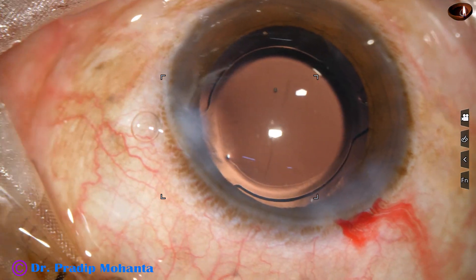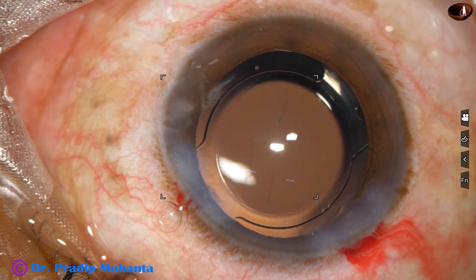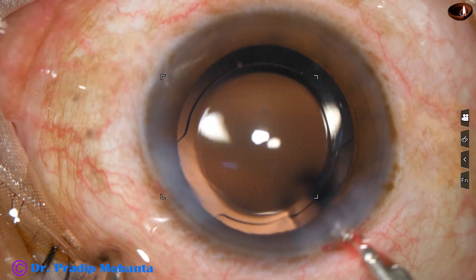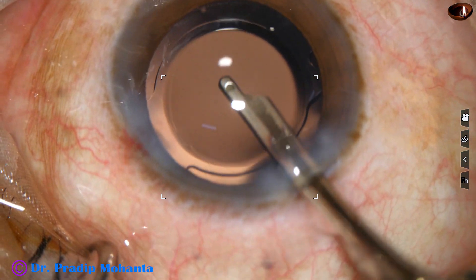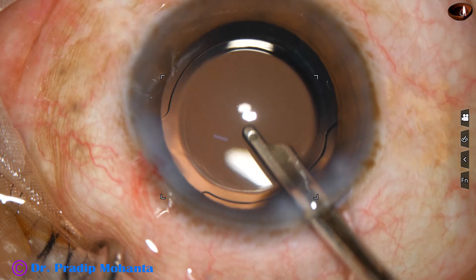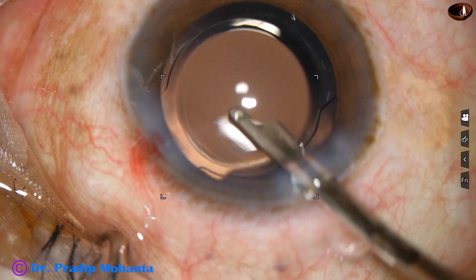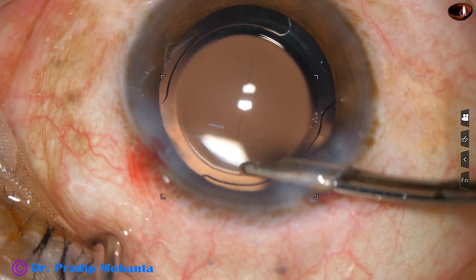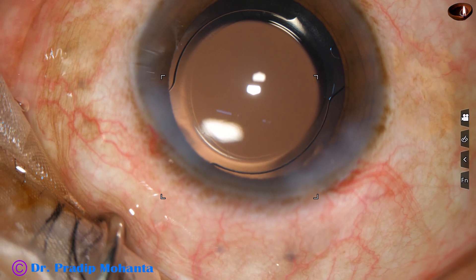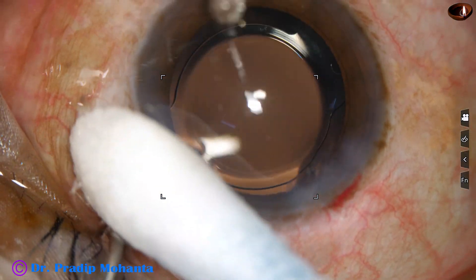I close the side port — in this case only one side port has been made. I close the side port by hydrating the corneal stroma. Now this is the final lavage of the anterior chamber. Then I just have to form the anterior chamber nicely. I prefer to form the anterior chamber with the help of this Simcoe cannula. I check the integrity of the wounds — there should not be any leakage from any side. And then conclude the case.